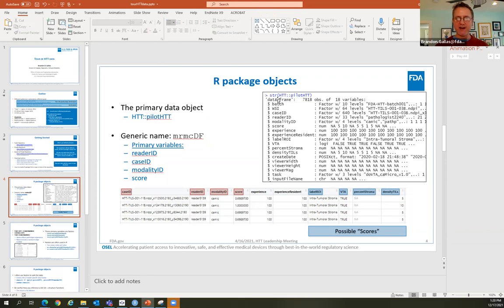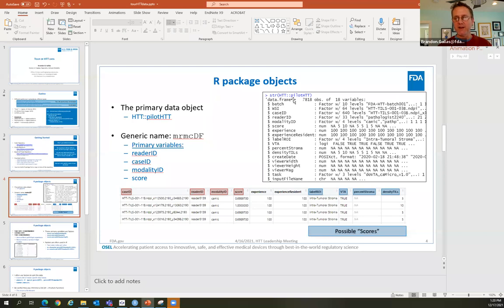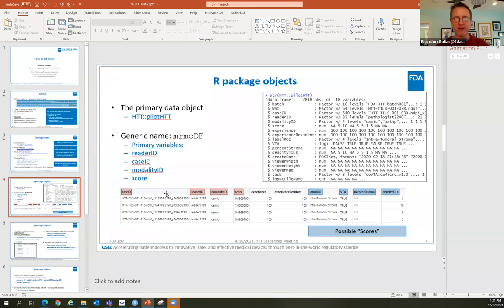In a lot of my code I have a generic name for a data frame with specific variables: the MRMC data frame — multi-reader, multi-case data frame. The primary variables are the reader ID, case ID, modality ID, and score. The score is very generic — you can put in TIL density, percent stroma, or the ROI classification label. It's initialized with TIL density because that's the heart of our project.